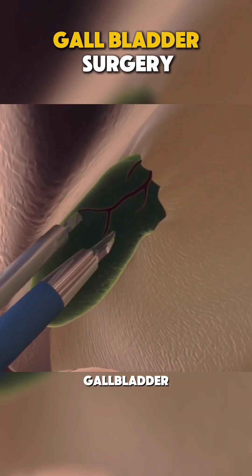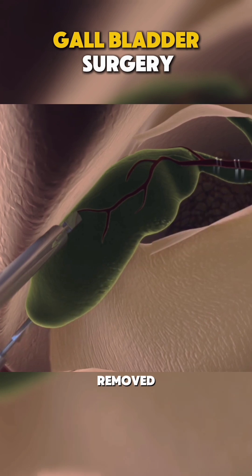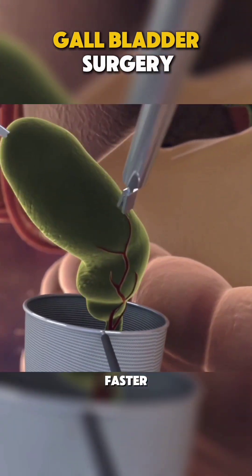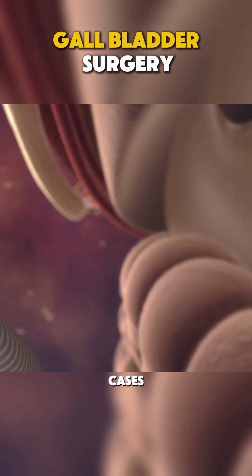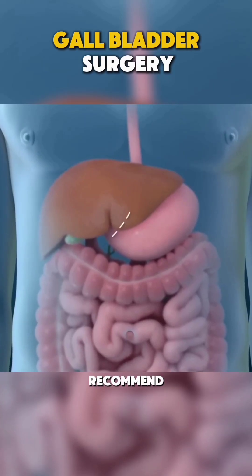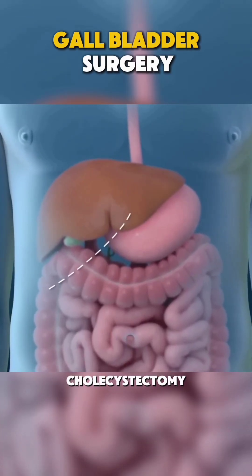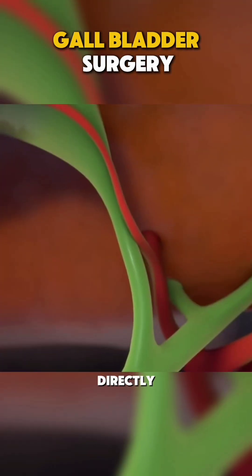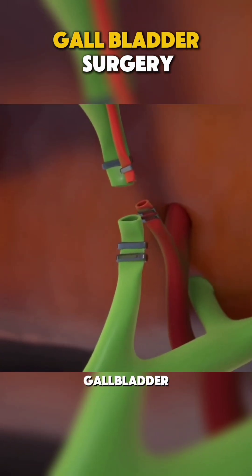Using small instruments, the gallbladder is carefully detached and removed. The advantage? It's minimally invasive, so recovery time is faster. But in some cases, the surgeon may recommend an open cholecystectomy. With open surgery, a larger incision is made in the abdomen to directly access and remove the gallbladder.